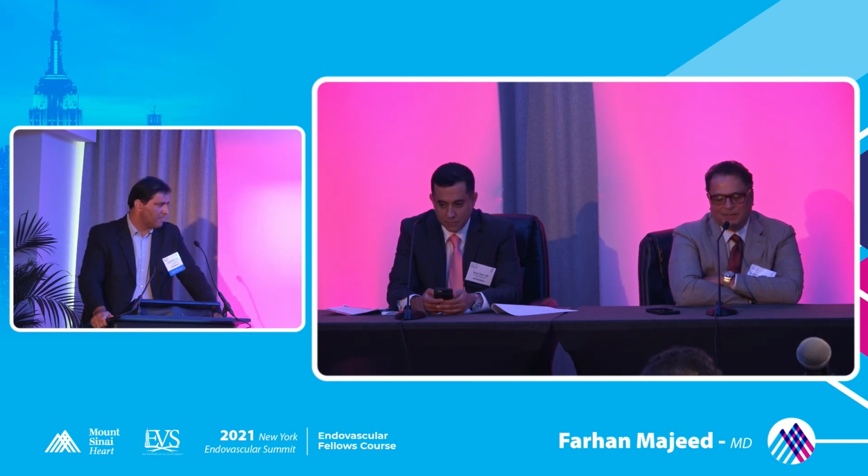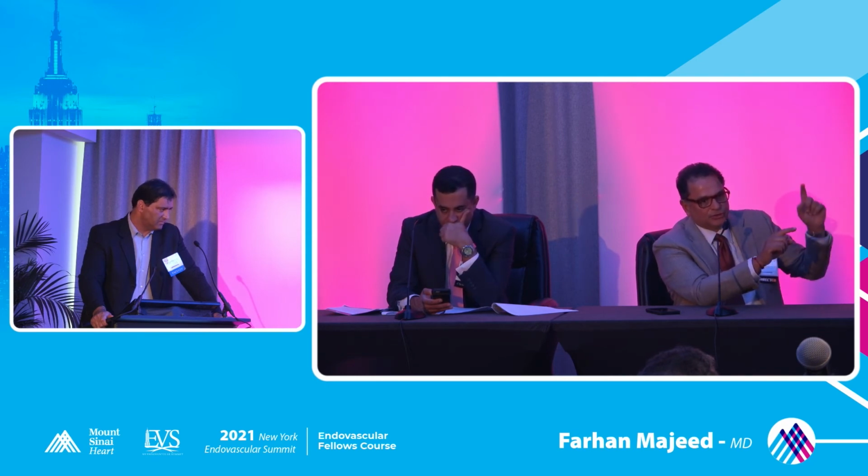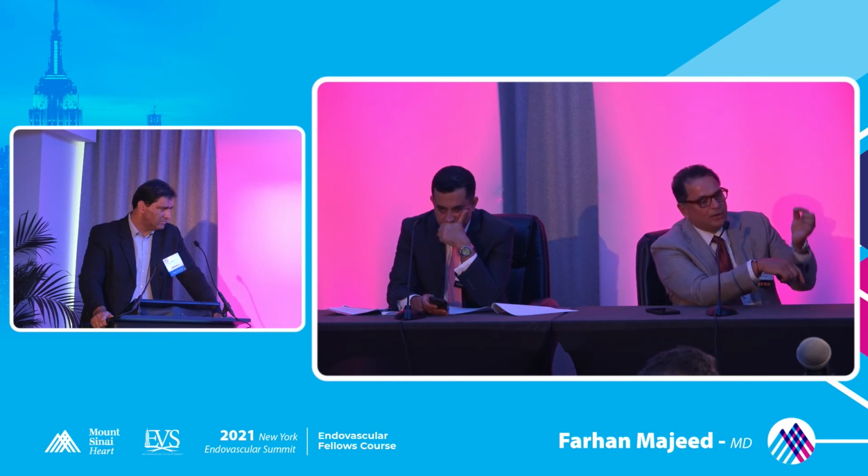And what I would suggest is that you use 2 wires. Remember, you have to look at the filter and see where the column stops. If there is a column in front of where your filter is, that means all that is debris material, so you have to start aspirating above, coming down. But if it's all inside your filter like this one, then you can go down into the filter and do it.